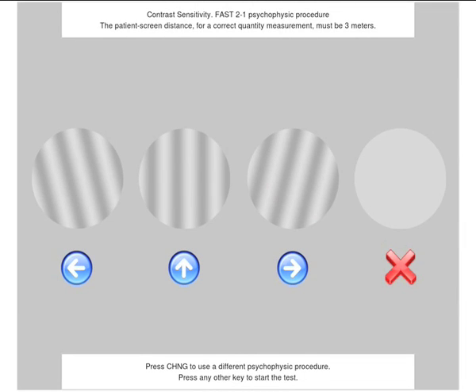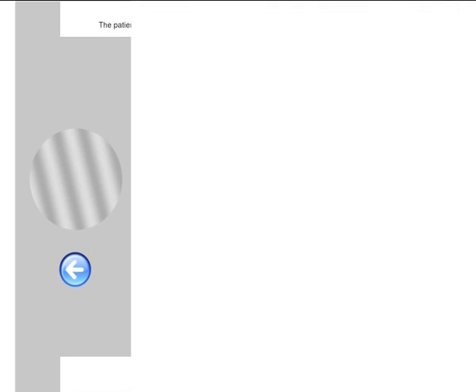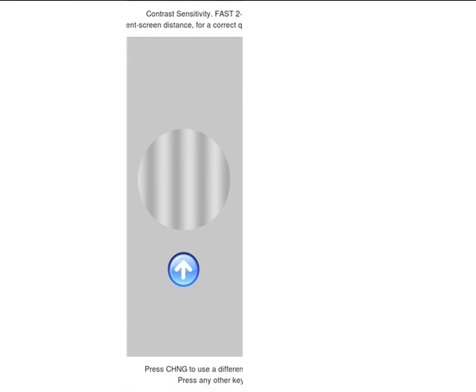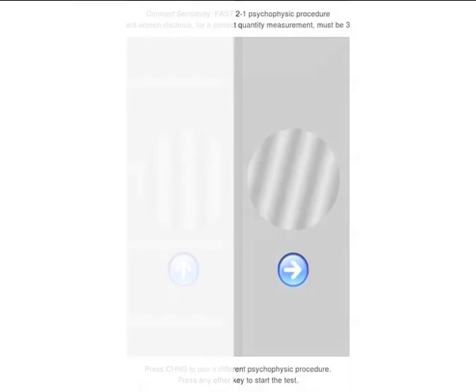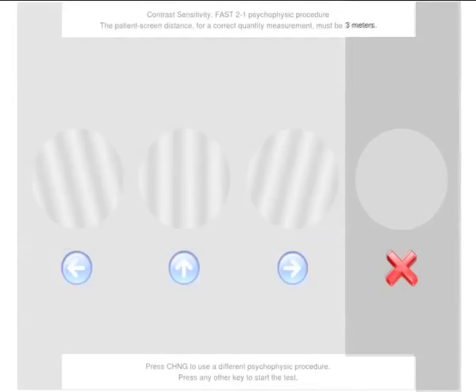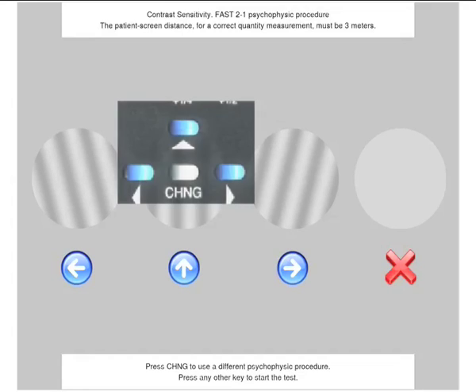At the beginning of the test, a screen will appear to explain to the patient the four kinds of forced answers expected. Leftward inclinations, inclinations of the vertical bars, rightward inclinations, and no recognized inclinations are linked to the red key. The other three answers are linked to the relevant cursor keys of the remote control.